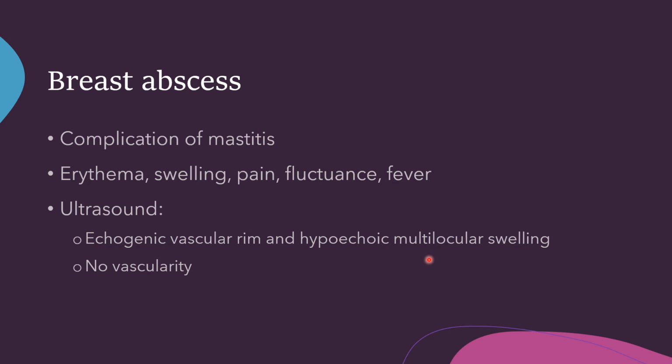And just to be noted, if you do a Doppler exam, you would not see any flow, thereby indicating that there is zero vascularity in a breast abscess.